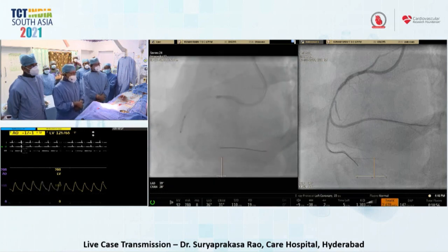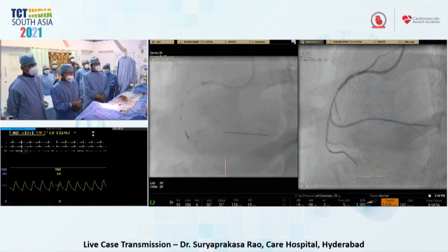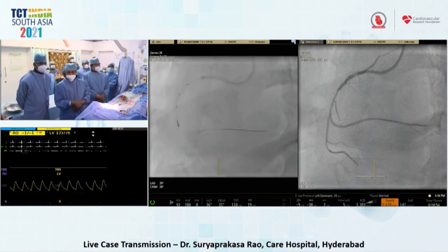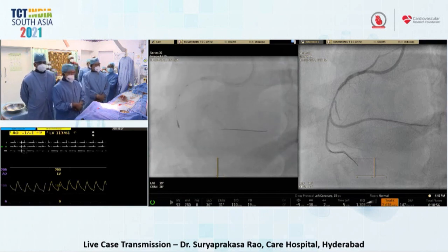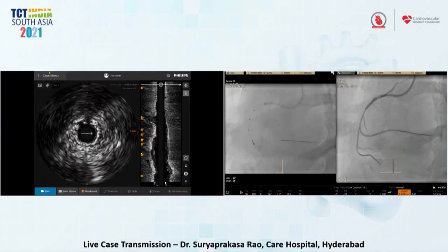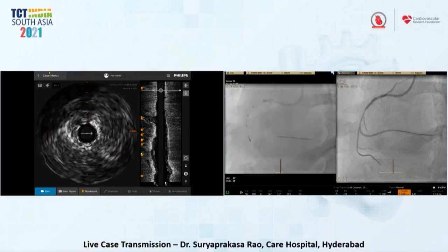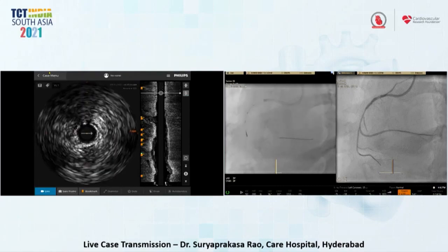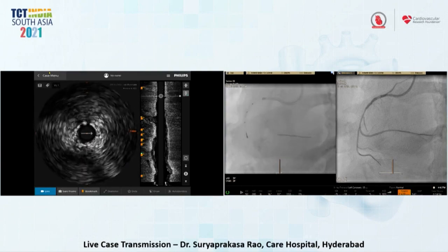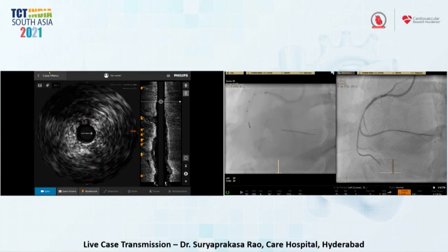And then after the pre-dilatation, we took the check injection. You can see we have done the IVUS here. Please read out the IVUS. To see the distal vessel size, because the distal vessel becomes contracted because of the CTO, we took exactly the vessel size to select the stent size. You can see on the IVUS that the vessel is almost contracted at 2.3, but after giving NTG injection it grew to 2.75 to 3. And then the CTO morphology is basically soft tissue.